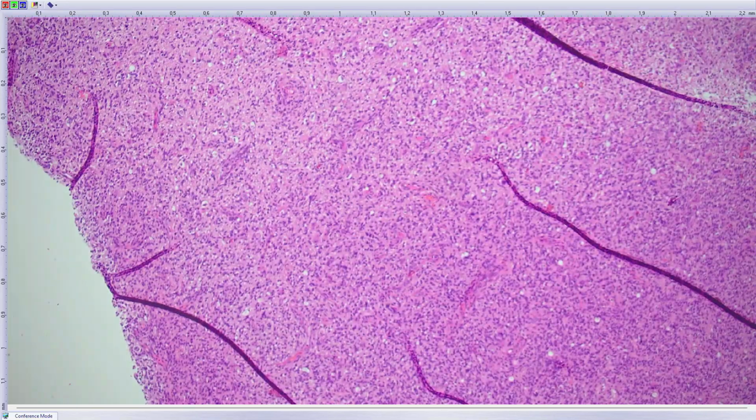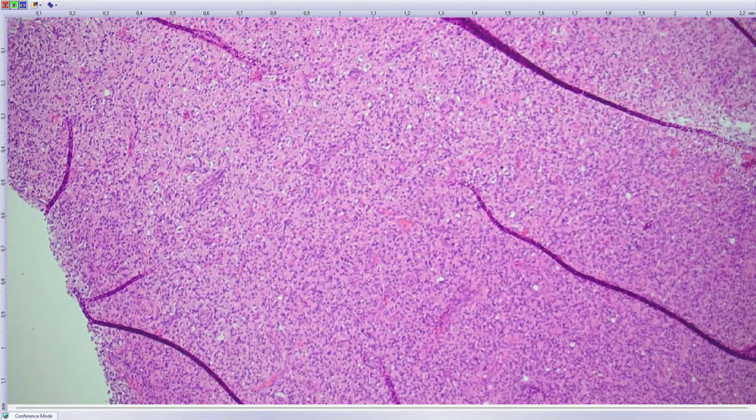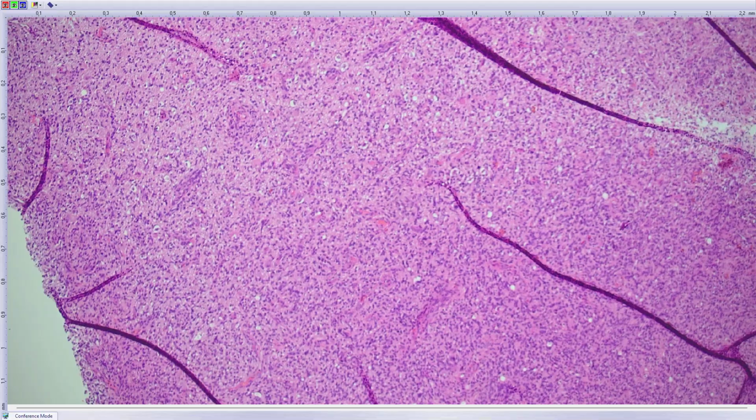The history of the patient goes back to the year 2011, so it's already 15 years ago. He was diagnosed and maybe treated with the diagnosis of meningioma, and then they changed the diagnosis, and this is a current recurrence.